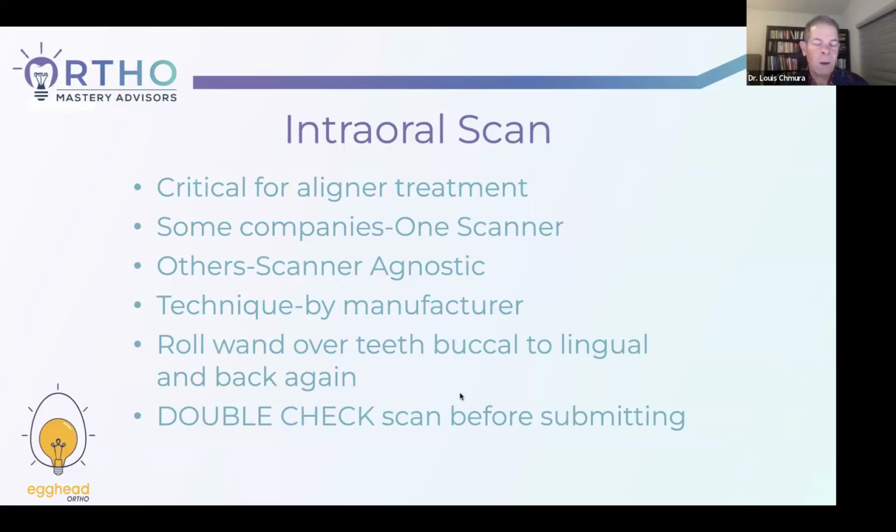It's almost impossible to get expansion unless you're doing it at 6 or 7 years old. And even then, there's more efficient ways to do them. And then efficiency in other ways. So you want to get a great intraoral scan. You can send the scan for appliances now, whereas you used to have to fit bands, take an impression, send it.